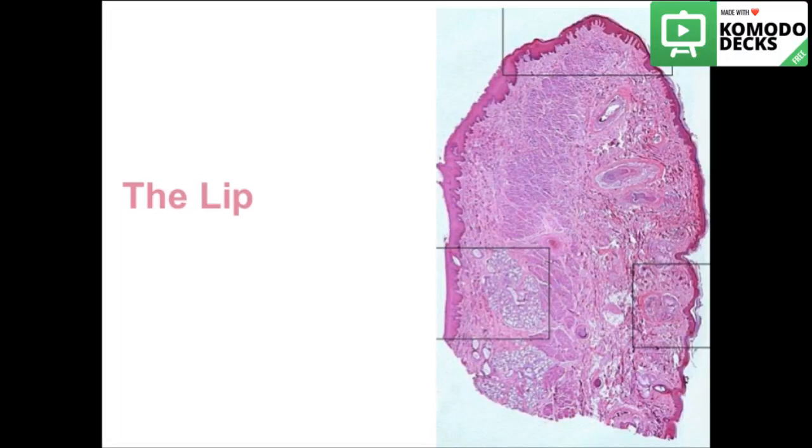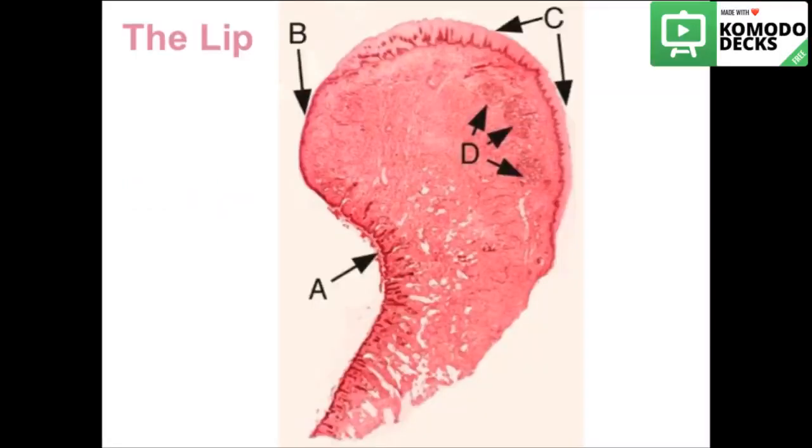We have firstly spoken about the lip with three parts, which are the skin epidermis, the vermilion or the red zone or transient zone, and thirdly moving to the labial mucosa. A transection of the lip. How to distinguish the three parts of the lip.